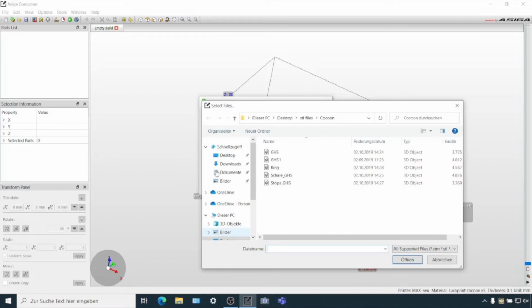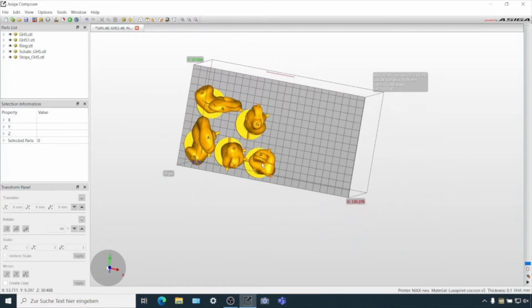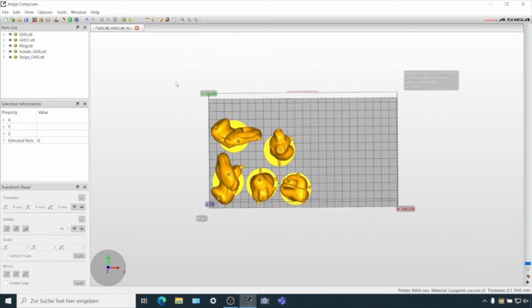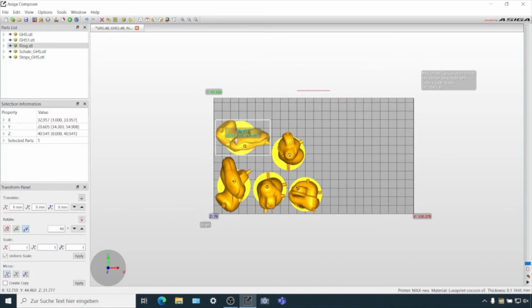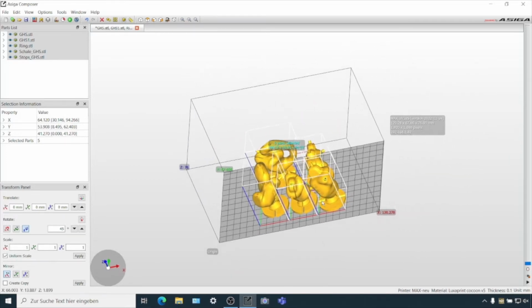Select Files. I have here some modeled files from before. Say Open and open again. For me, it's a better way to set the objects. If it's not complete, fulfill the platform, please set it to the middle of the platform. It's better for the printer.